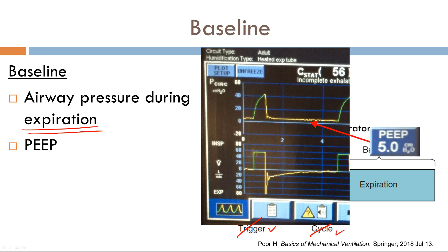we can see that the PEEP here is 5. This green line designates inhalation, and this yellow phase is exhalation. Remember that inhalation with a mechanical ventilator is a very active process — the ventilator is forcing positive pressure into the lung circuit. However, exhalation is a very passive process, and essentially depends on the chest wall and lung recoil to fully exhale all the inhaled air.